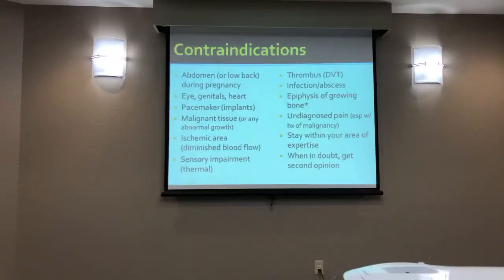I think it's an interesting one. I had a therapist at one of my courses a while ago who said, I don't get a lot of tennis elbow or golfer's elbow, the medial lateral epicondylitis, but he finds, and I have found this to be true in this environment, that people generally have a trigger point in probably their extensor carpi radialis. He found that if they treated it with thermal levels of ultrasound with stretch, they had significantly better outcomes than if they did not incorporate the ultrasound. That led me to the question, could you do E-stim point stimulation as well? This person said, I'm going to try it, because he happened to see a lot of that diagnosis. He never contacted me and let me know, but he was going to try a comparison. Will you contact me and let me know? Yes. Because that way I can follow up.